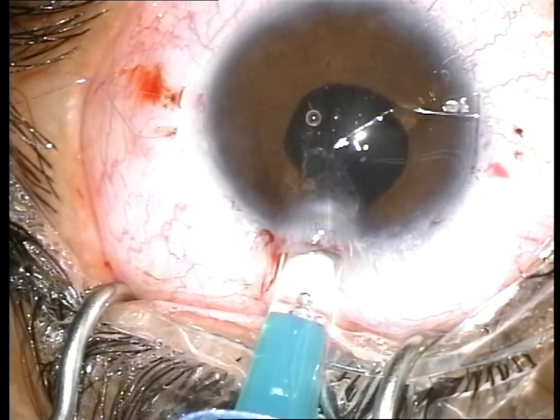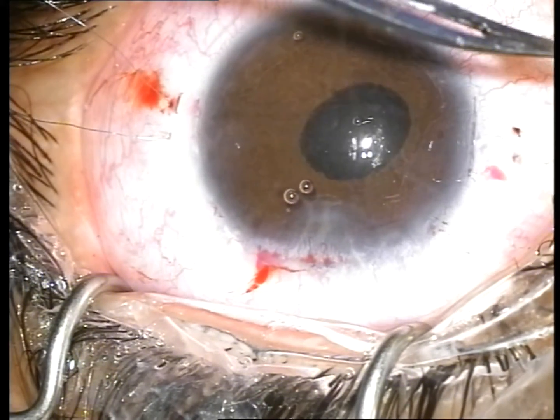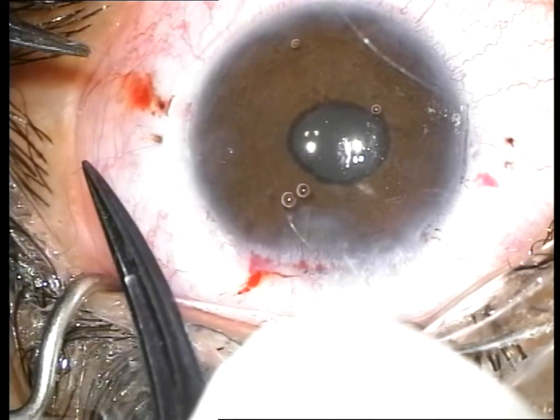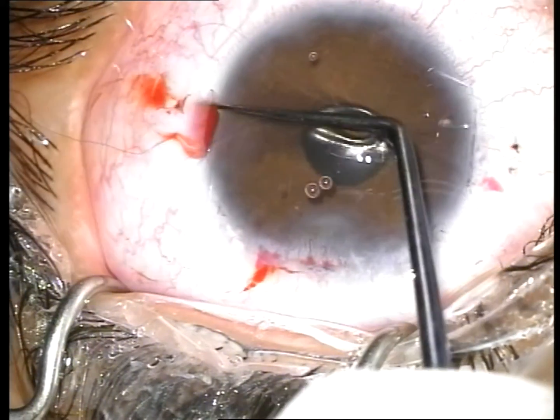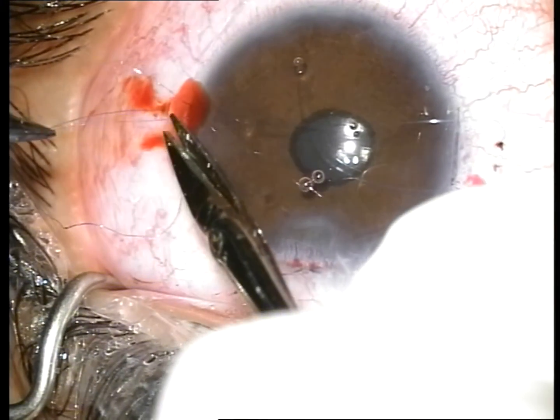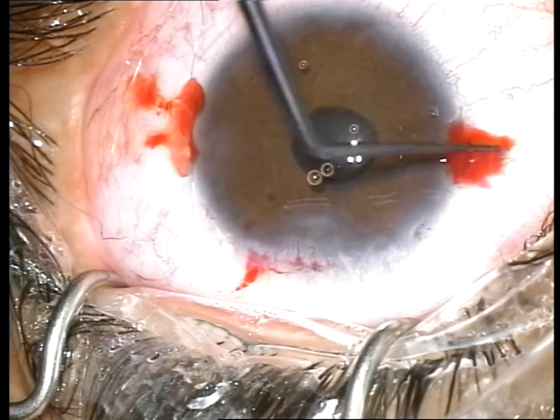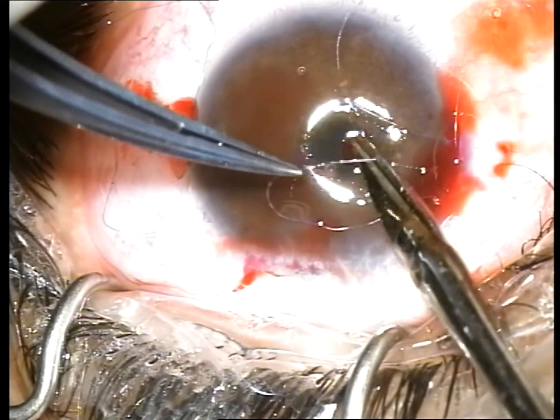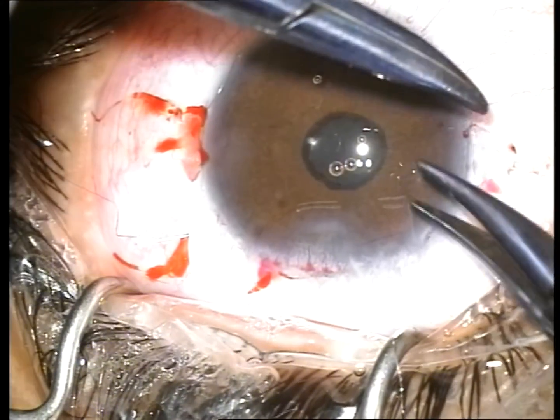The IOL is inserted into the posterior chamber. After evenly tightening the suture, the IOL sits in place and is centered. The suture is retrieved through the scleral pocket using a Sinski hook. The sutures are trimmed and tied, re-centering the IOL and allowing the knot to slide under the scleral pocket.